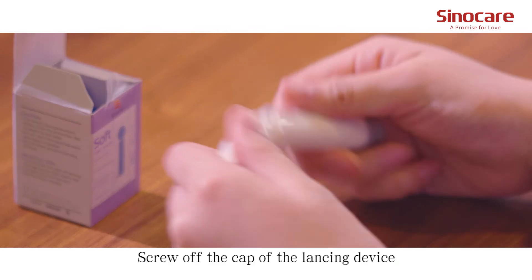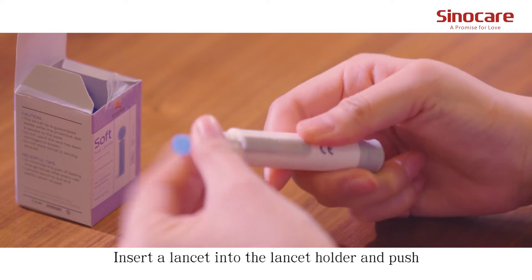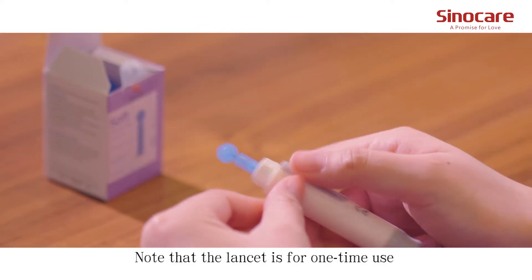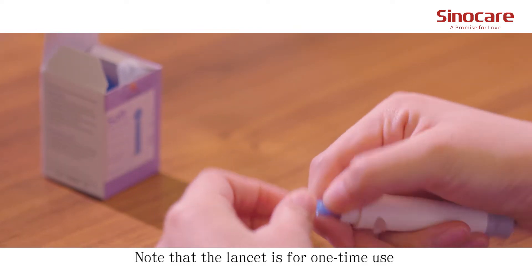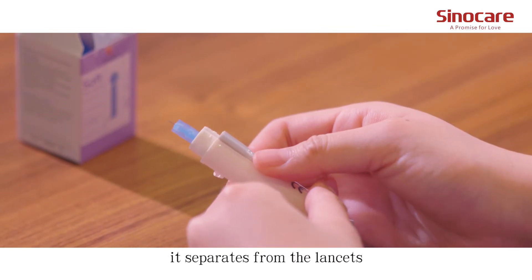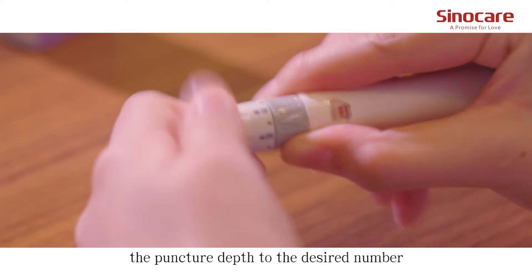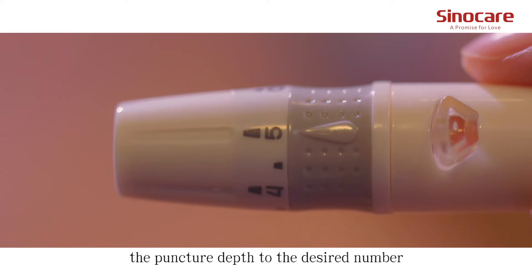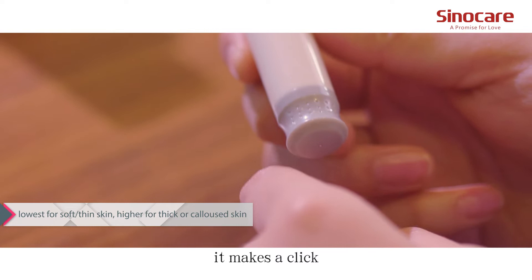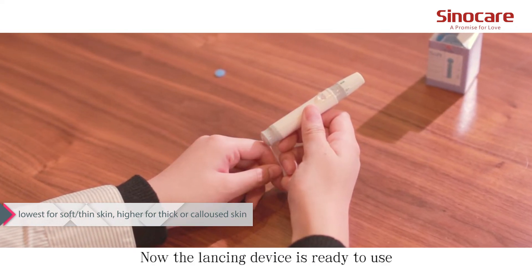Screw off the cap of the lancing device. Insert a lancet into the lancet holder and push down until it's fully seated. Note that the lancet is for one-time use only. Twist off the protective cap until it separates from the lancet. Replace the lancing device cap and set the puncture depth to the desired number. Pull back the cocking control until it makes a click, then release. Now the lancing device is ready to use.